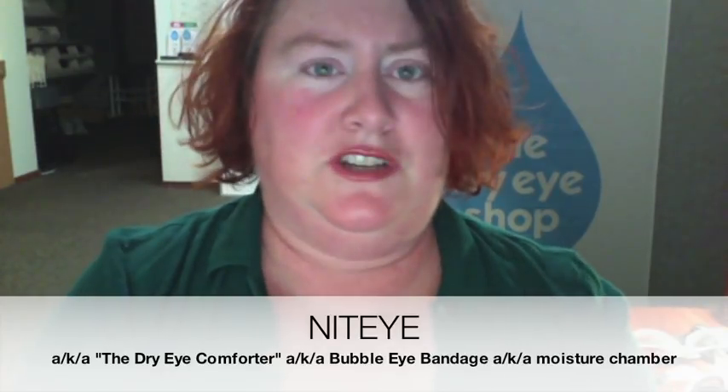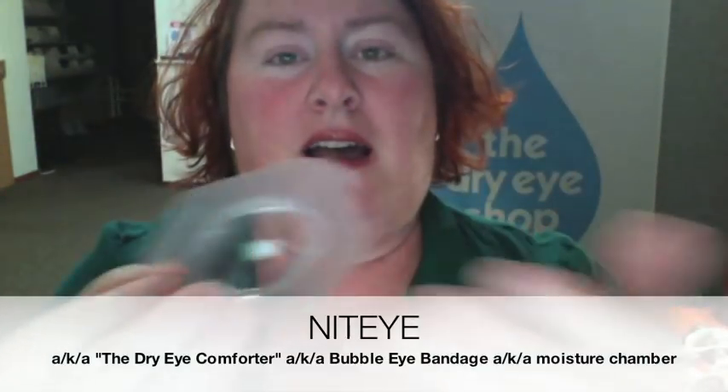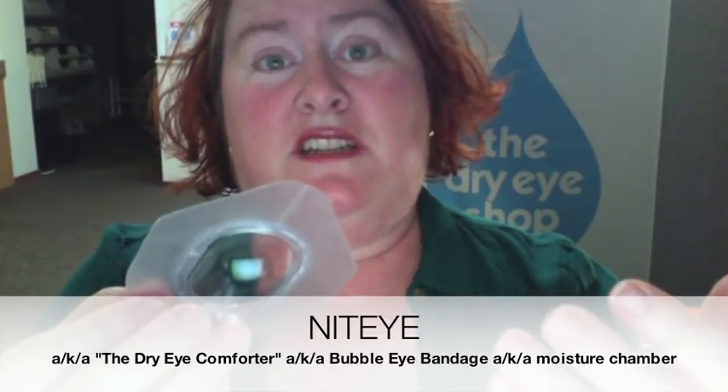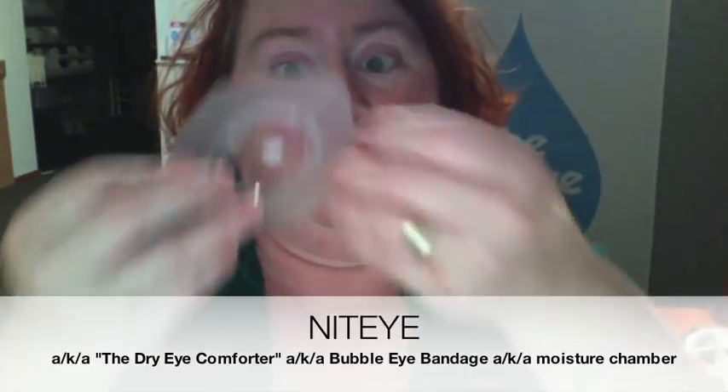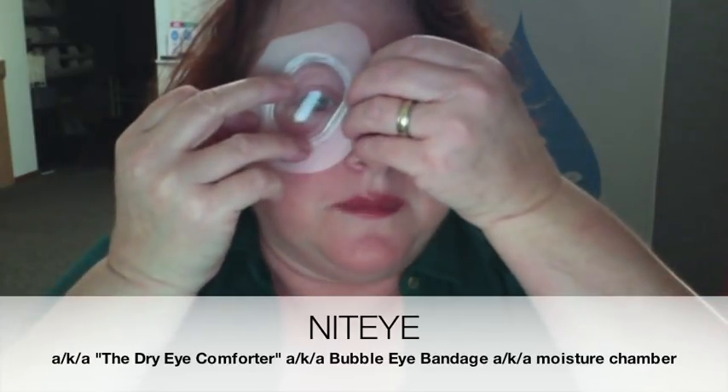So those are the first batch of sticky things — that's the tapes. We're going to look next at the bubble eye bandages. This is what we would call a moisture chamber — anything that is going to seal your eye in is what I would call a moisture chamber. I don't actually know the right way to put these things on; I just know the way I would do it, and that's with the arrow thing kind of pointed to the middle of my forehead.